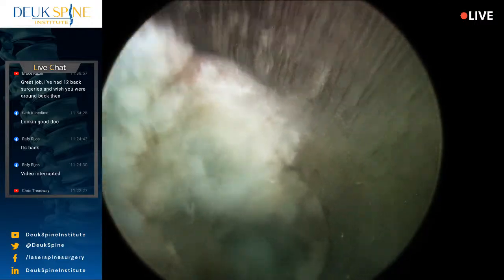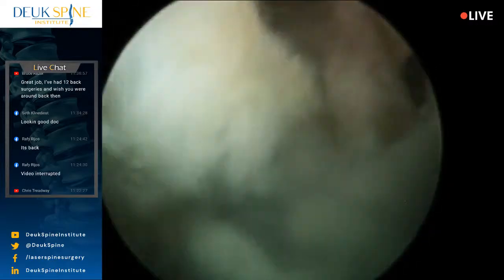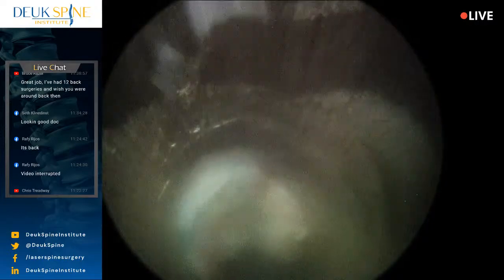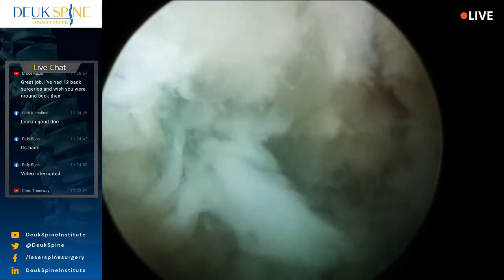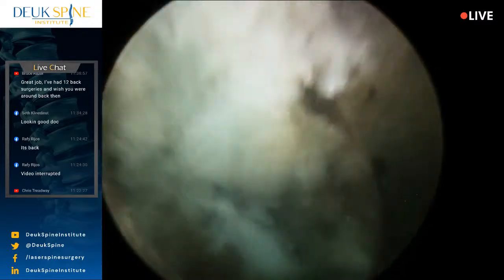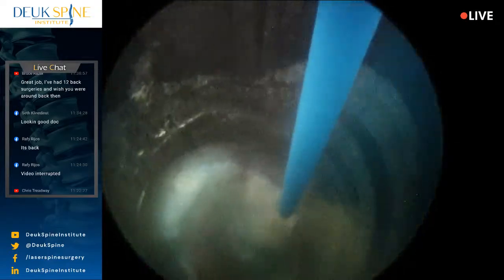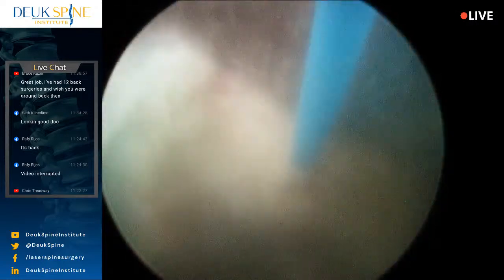All right. Now you can also see that the grabber is not a very good tool at removing herniations that are still stuck down. It's a good tool for removing herniations that are loose and freed by the laser. So for those people who say laser is not necessary for spine surgery, honestly, they have no idea what they're talking about. Because if they actually knew, they would know how valuable the laser is.